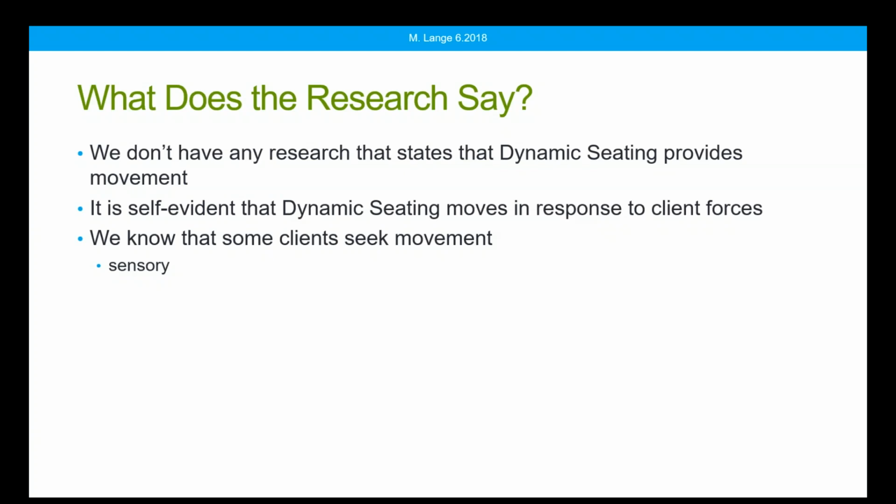Now, we don't have any research that actually says dynamic seating provides movement, because it's self-evident that dynamic seating moves in response to client forces. That's its definition. We do know that some of our clients seek out movement, often for sensory stimulation. I'm convinced, and I'm sure a lot of you would agree with me, that many of our clients have quite a bit of sensory deprivation because they're stuck in these positions.